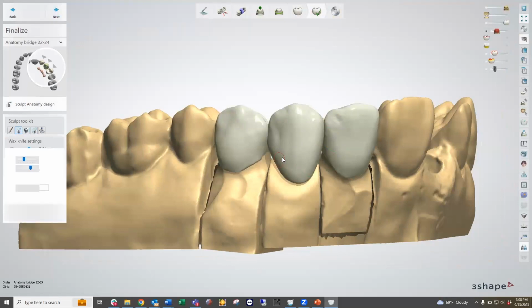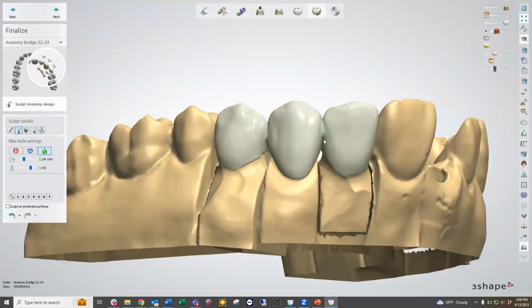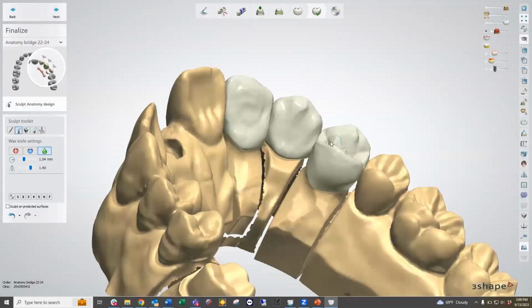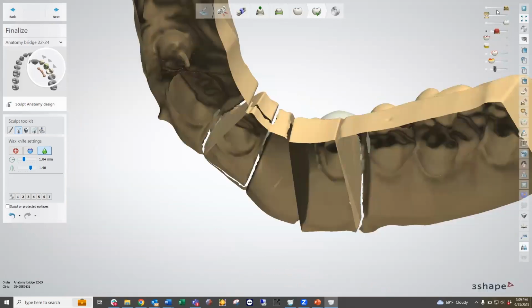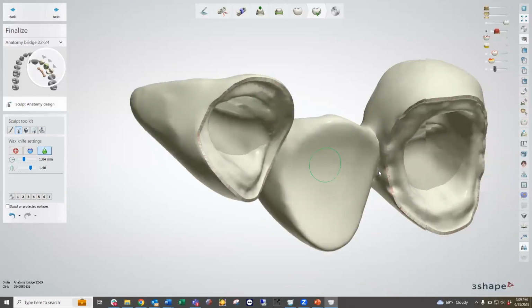I can make any sort of last minute changes at this moment, but simply what I'm going to say is, if we saw that our unit was good in design and functionality, I like to go along the interproximals just briefly, just to smooth it up, and you can see it emboldens that connection between those 2 units. So I just use the smooth tool ever so slightly, and this allows us to see what that final unit will look like as a bridge. And I can turn off my model here. This allows me to get the underside.